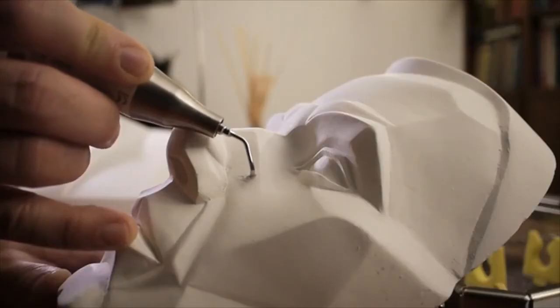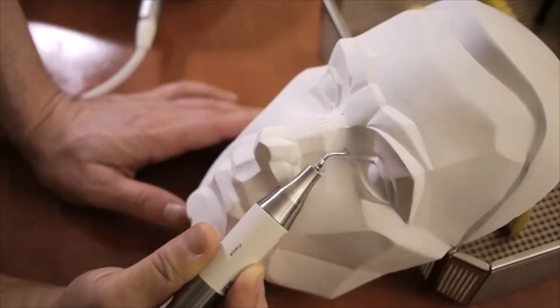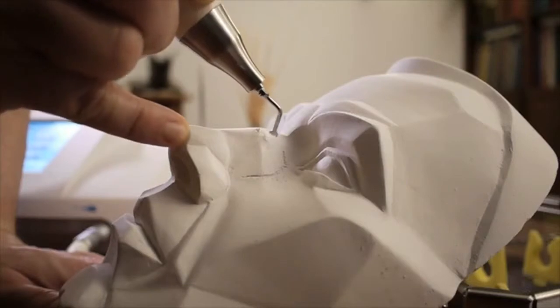Well, I have adapted the use of piezosurgery to rhinoplasty in 2 ways. First, by designing special piezoelectric instruments for rhinoplasty. Second, by doing systematically an extended subperiosteal dissection of the whole bony vault to assess the bone characteristics and to allow an easy use of the piezo instruments.